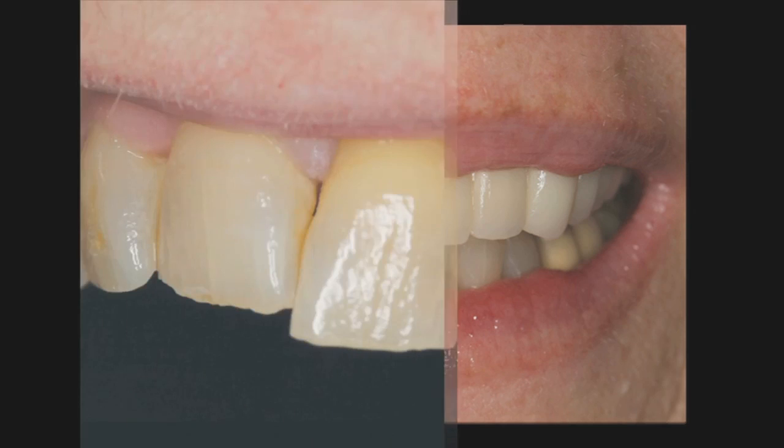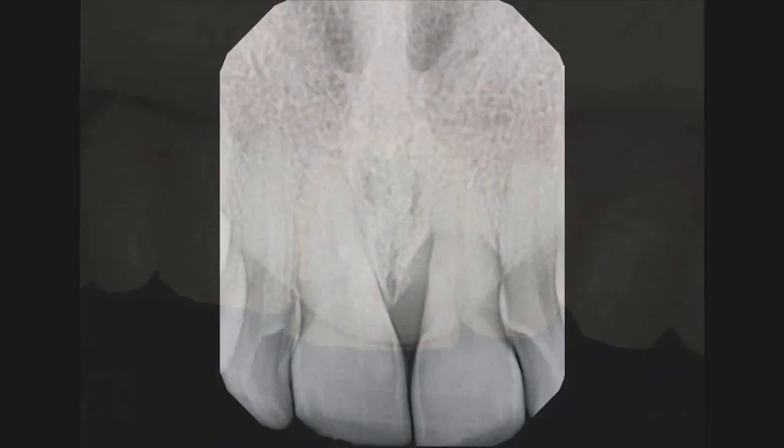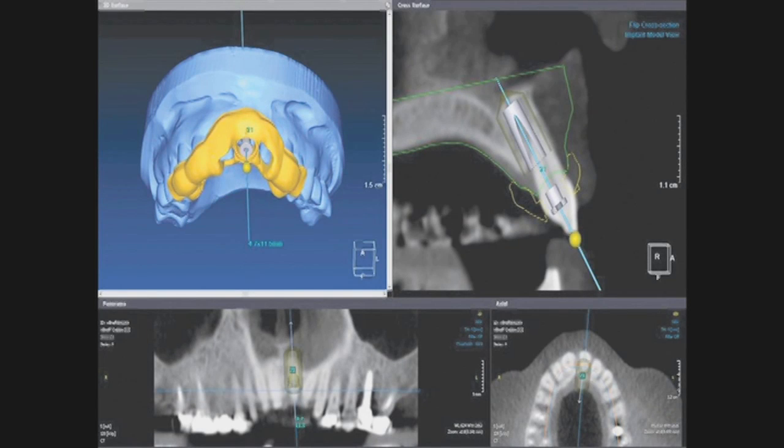Amazing. Our second case was a person who had a periodontally involved maxillary left central incisor. The tooth had supererupted, was mobile, and was obviously an aesthetic concern for our patient. Figure 2 demonstrates the digital radiograph of the periodontally involved maxillary left central incisor, tooth number 9.